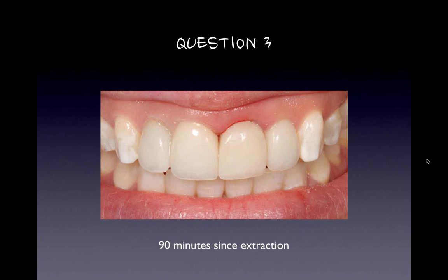Oh, I'm assuming he means the central, I think. Please ask the question, be more specific on which case, because I don't want to answer incorrectly. With your anterior veneer suck-down matrix, how are you achieving proximal separation? Everybody asked the question. I'm sorry I didn't cover it. Again, we're putting them all in together, and then we're separating them and then just adding the contacts afterwards. Sorry that I wasn't clear on it.